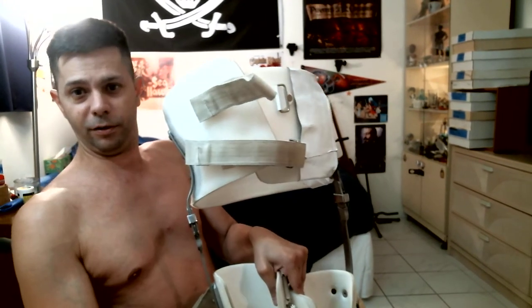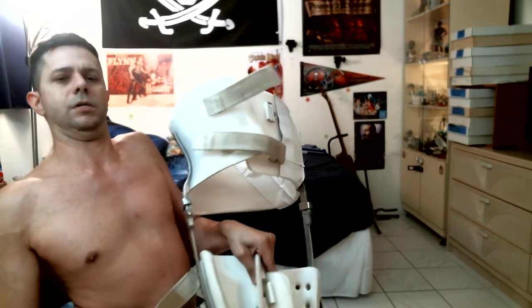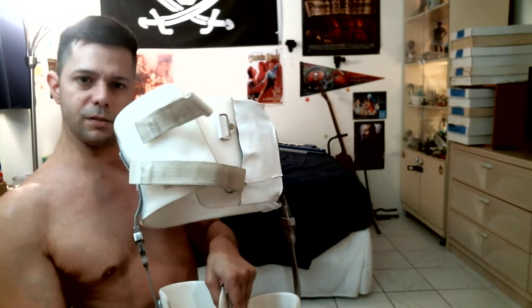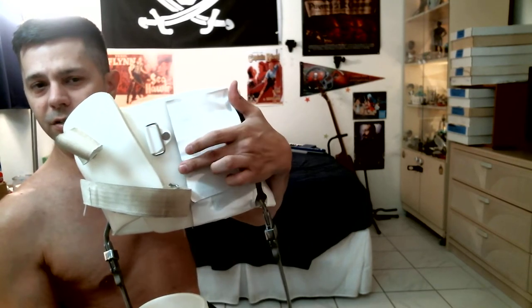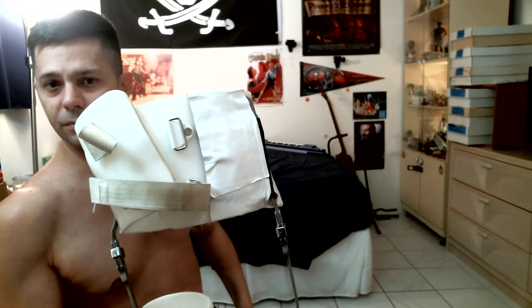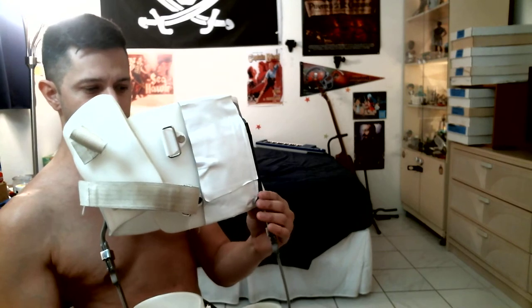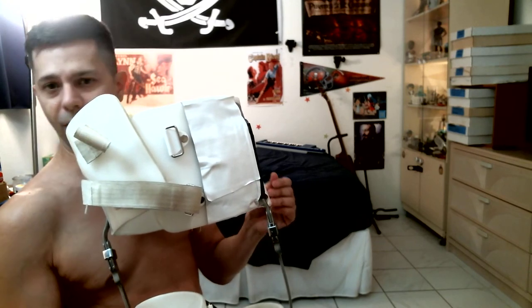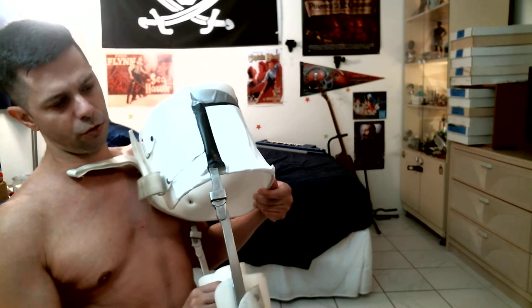Initially I put duct tape on them to try to keep them together, and that didn't work well at all. But now I put flex tape on, and that worked quite a bit better — but even with that they're still not holding together too well.